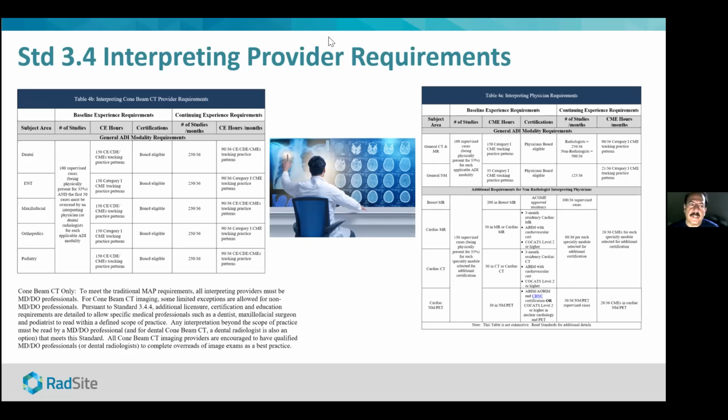Yeah, so as you were mentioning, it's not just a radiologist, it's another practitioner, a dental practitioner, that has been interpreting these studies. For each one of the studies that they would have already done, the question is: is there a report that has been generated for those studies?